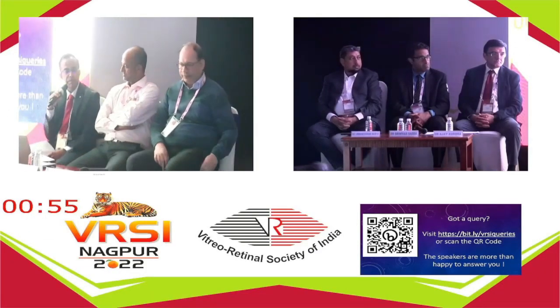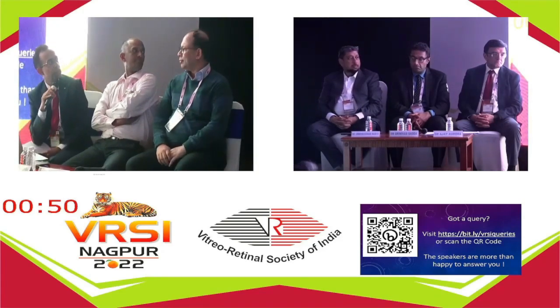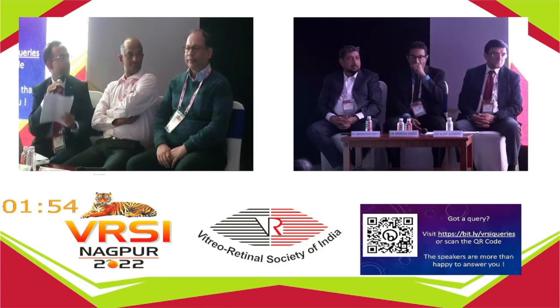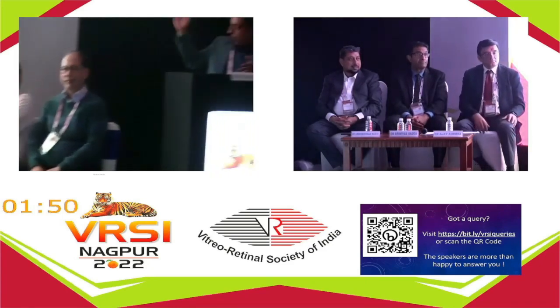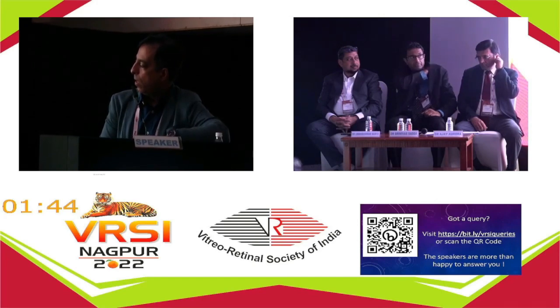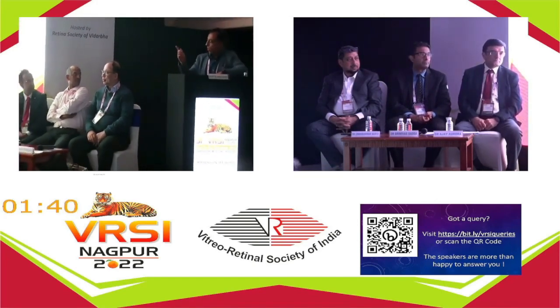The wide angle images that you're showing, are these steered images? The post-op and steered images? Steered. Ask the patient to look in one direction, and so some of them are 160 degrees, and the ultra wide fields are montages, of course. Where you ask the patient to look up and down, and you don't get the eyelash artifact. Not like what you see with Optos.